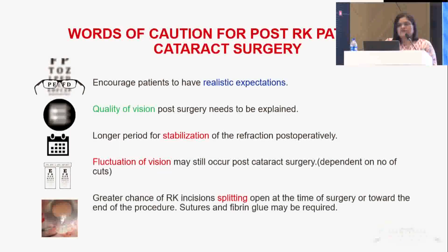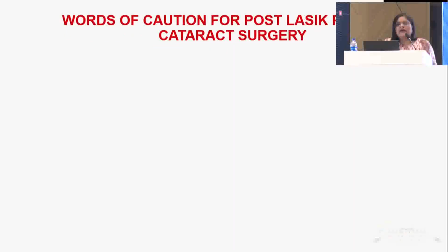So, words of caution: realistic expectations, quality of vision to be explained, longer period of stabilization, fluctuation of vision may happen, and there can be a greater chance of RK incisions splitting open at the time of surgery or towards the end of the procedure. Sutures and fibrin glue may be required during the surgery.